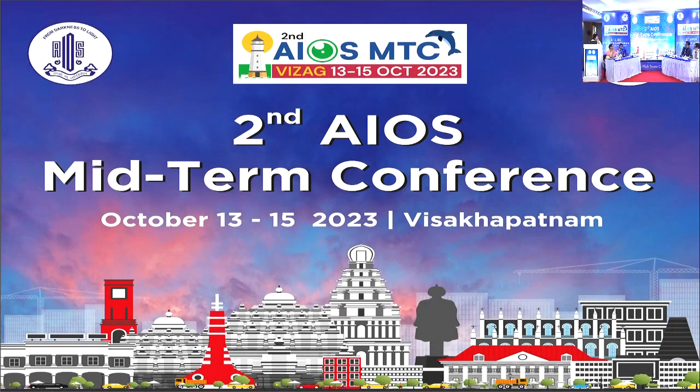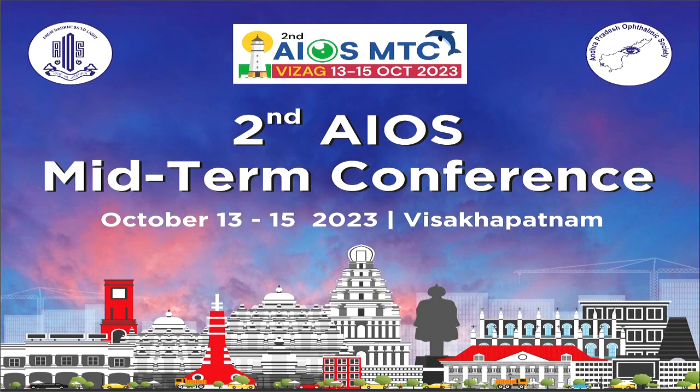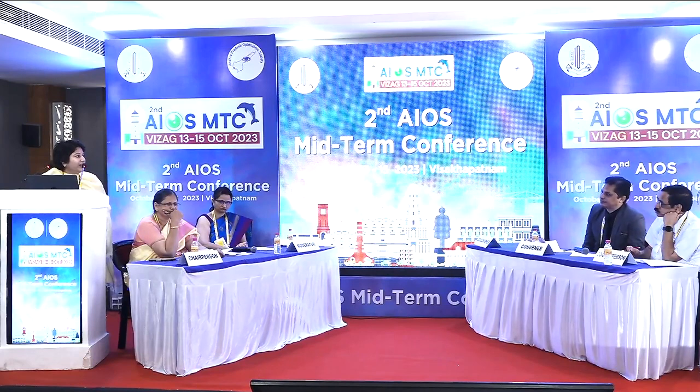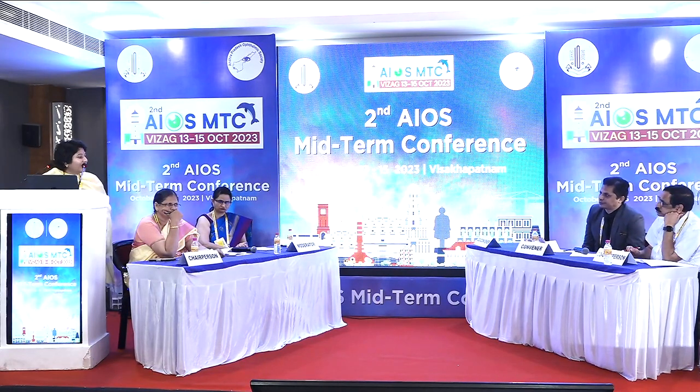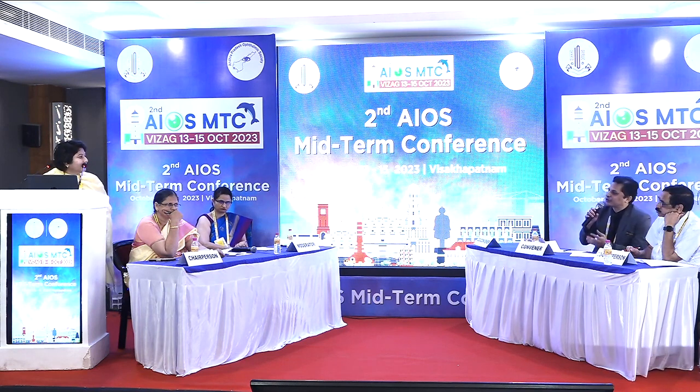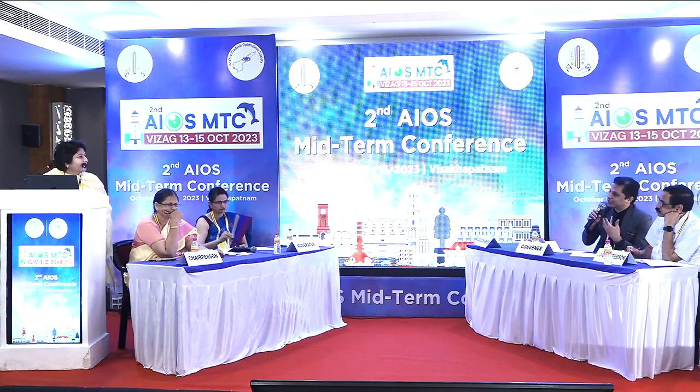Differentiate between a bacterial and this one, like with ASOCT. In all cases of fungal, you are getting the same features? So we have done it only for fungal keratitis, sir, and 2 cases of bacterial where the border is not wavy, it is a clear border between the endothelial plaque and the endothelium. Can you say how correct it is?